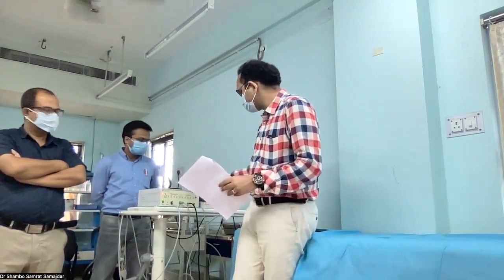and specifically we will demonstrate this today with one specific machine we have, that is the body scan. But we can also do this type of test in our own clinic without any specific instrument, only by telling patients some maneuvers. We can explore whether the patient has cardiac autonomic neuropathy or not.